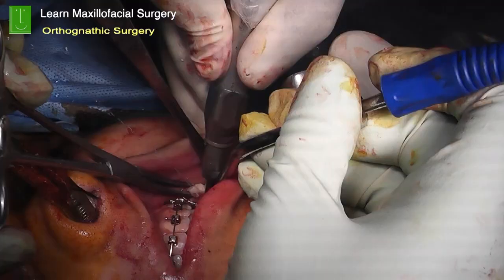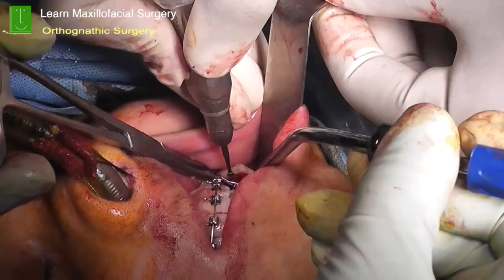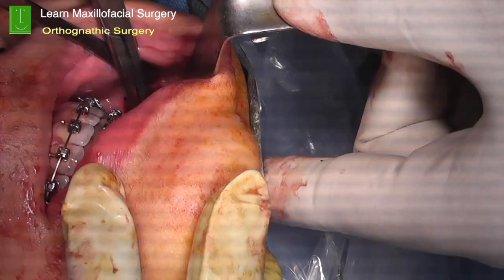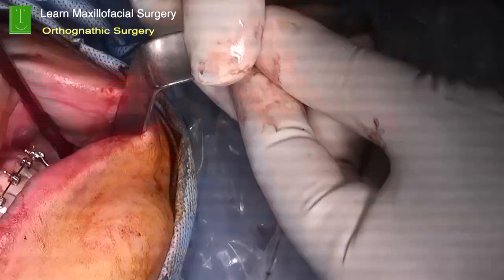So there is a differential movement which we have incorporated into this. And once the bone has been cut, then you need to smoothen it so that it nicely adapts into the second component. Whatever rough edges are there, you need to take them out so that you get a good approximation of the bone, on which you can use a four-hole, titanium 2 mm plate to fix.